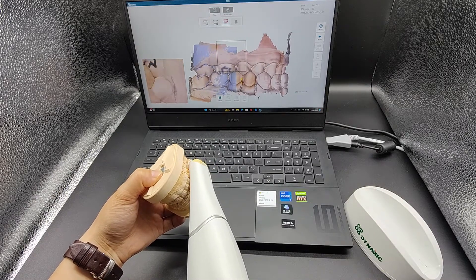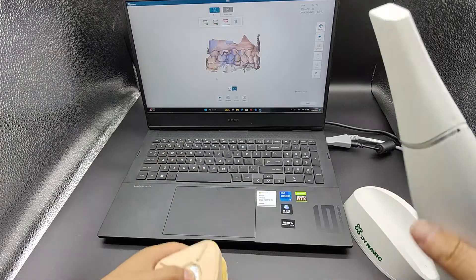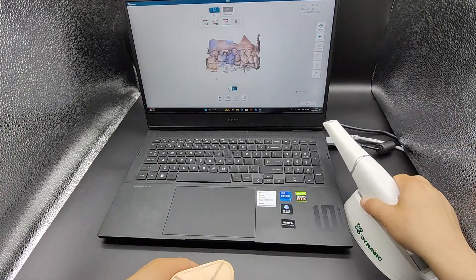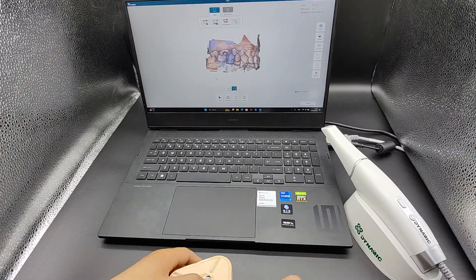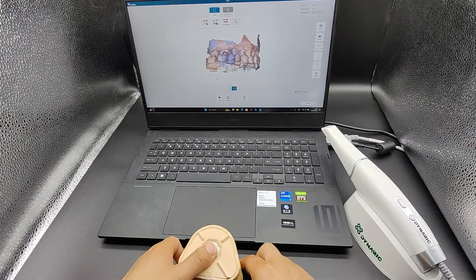It is recommended to scan the bite relationship on both sides, left and right. Finally, the best way to become proficient is to practice more.